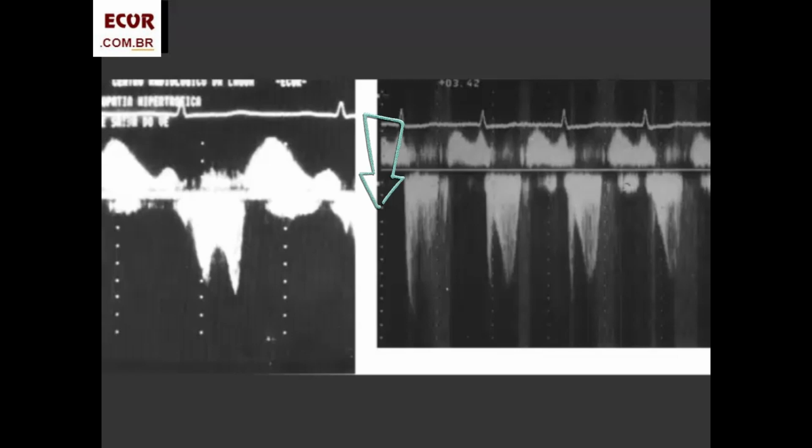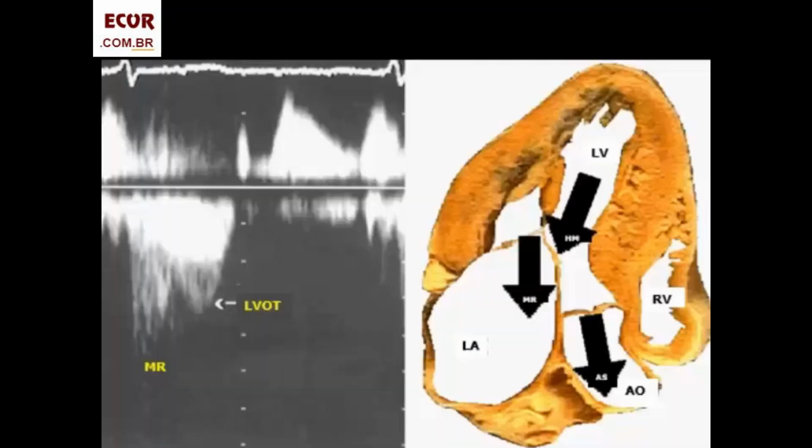cardiomyopathy. While directing the cursor to the LVOT slide posteriorly, two peaks may appear. What happens here is the simultaneous demonstration of two different flows. The initial one is a mitral regurgitation that almost always exists when there is a left ventricular outflow tract gradient, and the final one is the late peak of a subaortic gradient.